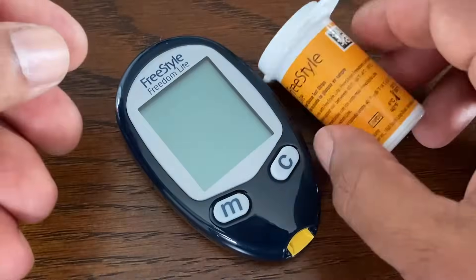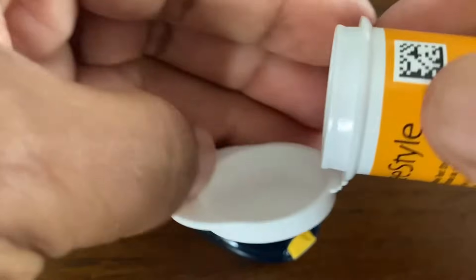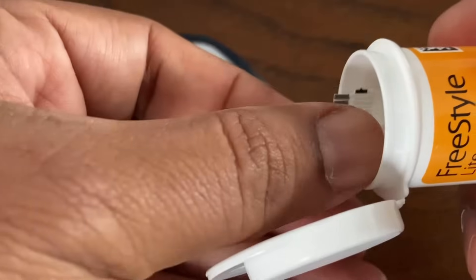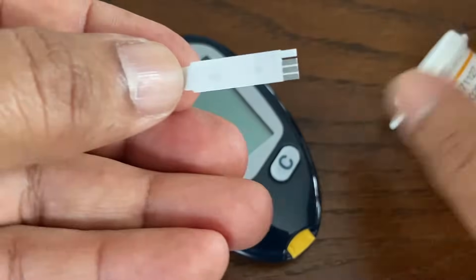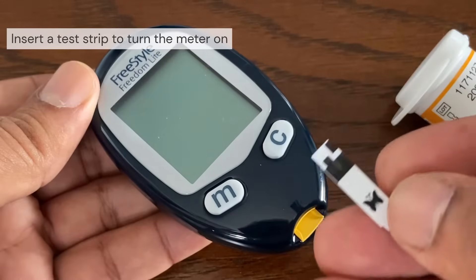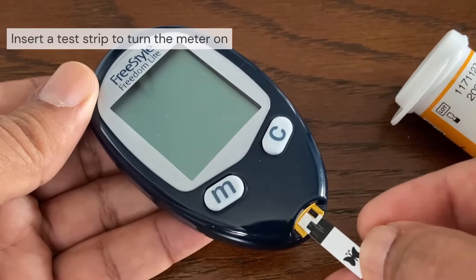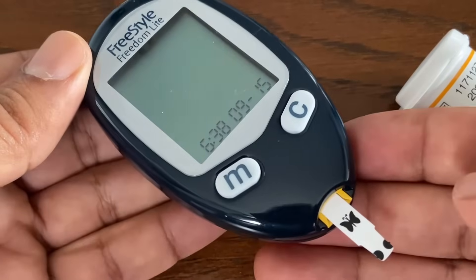Use Freestyle Light Test Strips. The test strips are for single use only. Do not open the test strip vial until you are ready to remove a test strip and perform a test. Use the test strip immediately after removing it from the vial. To turn the meter on, simply insert the test strip into the meter with the printed side of the test strip facing you.